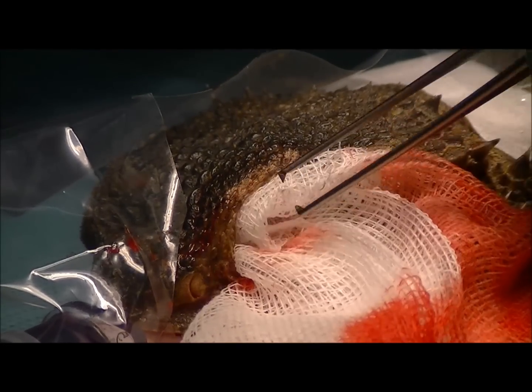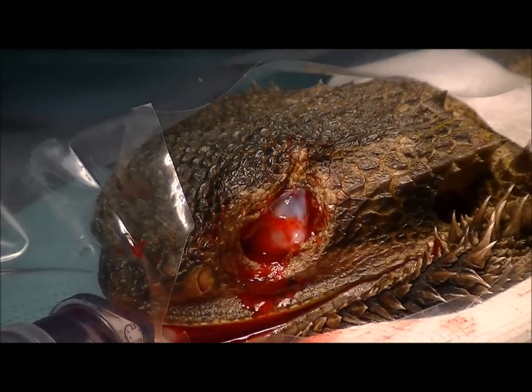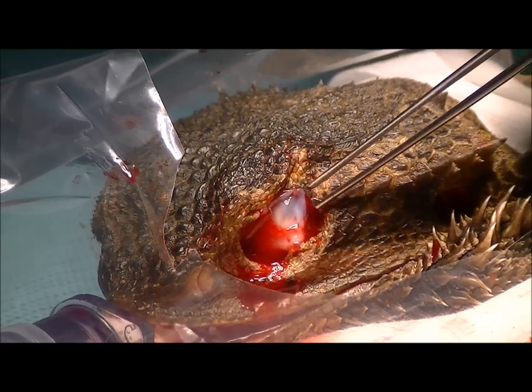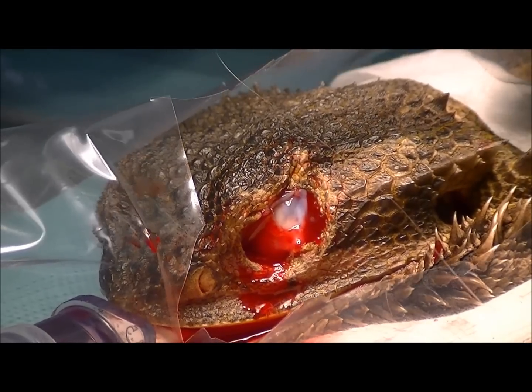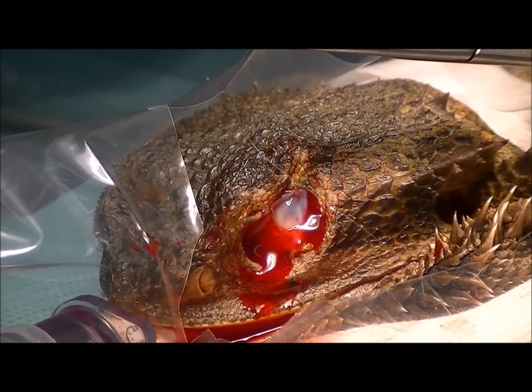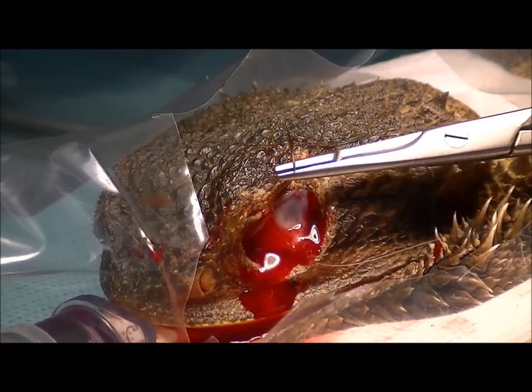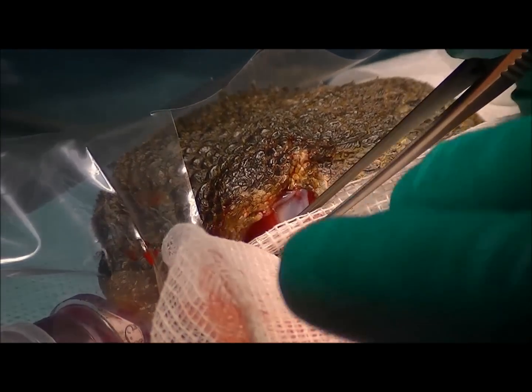We're about halfway through putting this third eyelid in place. You can see we've now got that tissue across the hole — I've got three stitches in there at the moment. We're using a suture material called PDS. It's very, very fine — about as fine as human hair — also very expensive, so we don't waste it. But it's dissolvable; we don't want to take these stitches out, they'll dissolve over time. We're going to work our way around the eye and stitch that third eyelid all the way around to form a framework for scarring to occur.